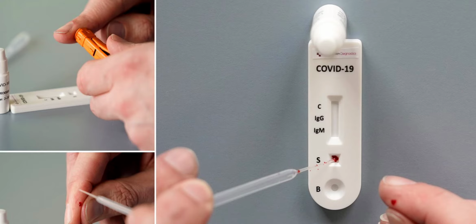In some cases we have both IgM and IgG from the same sample, then the person is infected by coronavirus. Either one kind of antibody is enough to say that you have a positive case of COVID-19.